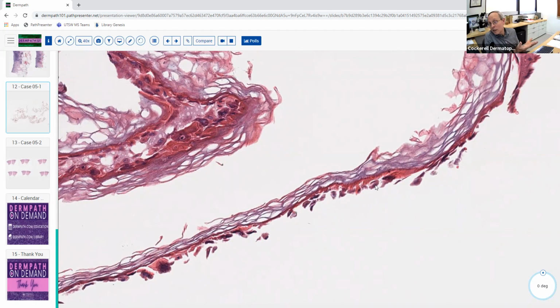They're keratinocytes, obviously. But what's abnormal about them? Dyskeratotic. Yeah, there's some that may be dyskeratotic. Yeah, I think that's true. What's the main change of them? They're discohesive. Yeah, discohesive or acantholytic. So when you see something like this, what do you think this looked like in the person?